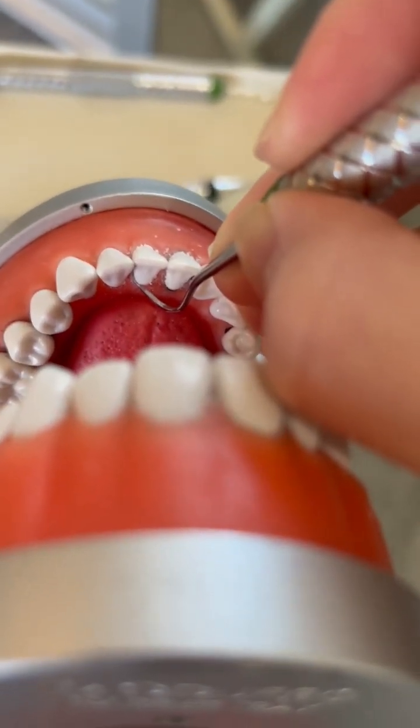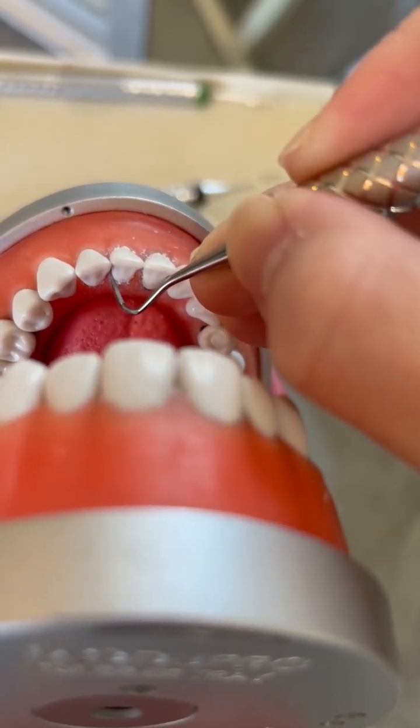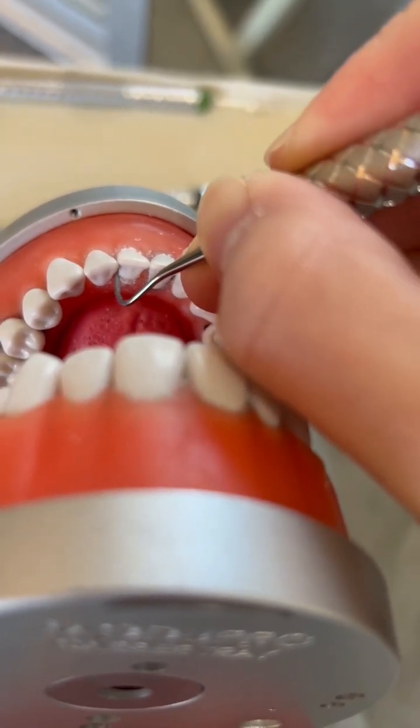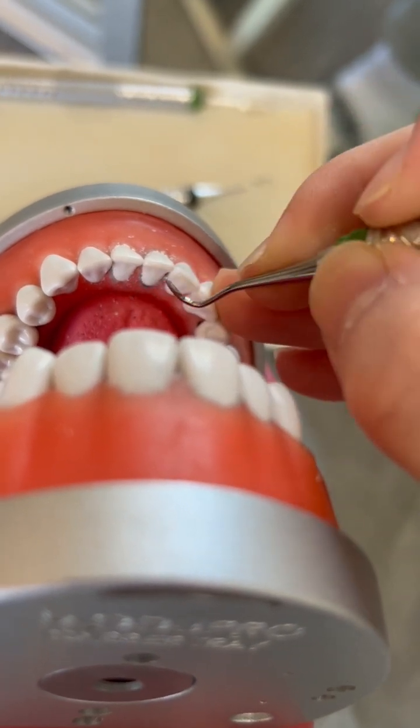Start at the midline, side to side, pivot and roll, side to side, pivot and roll. Only go half of the interproximal space, as it is a sharp instrument.